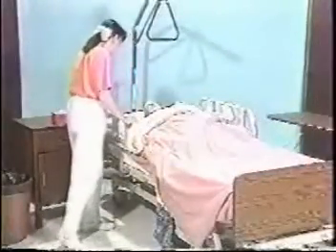Dispose of supplies. Remove your gloves and wash your hands. When you return, lower the bed to its lowest position and adjust the side rails for safety if needed. Finally, wash your hands.